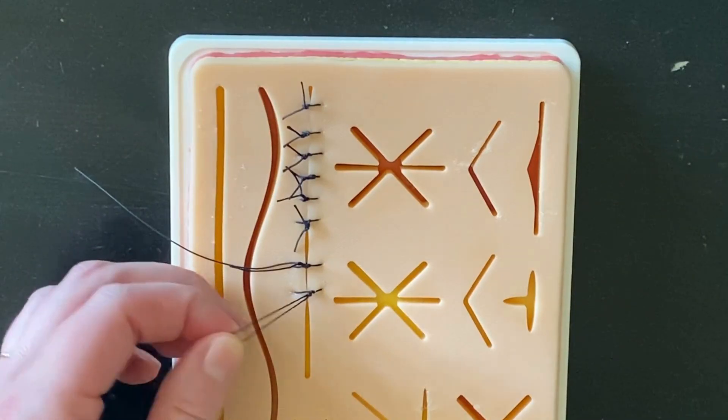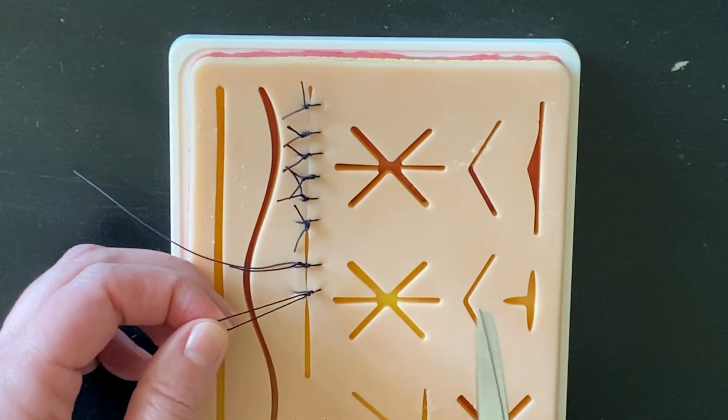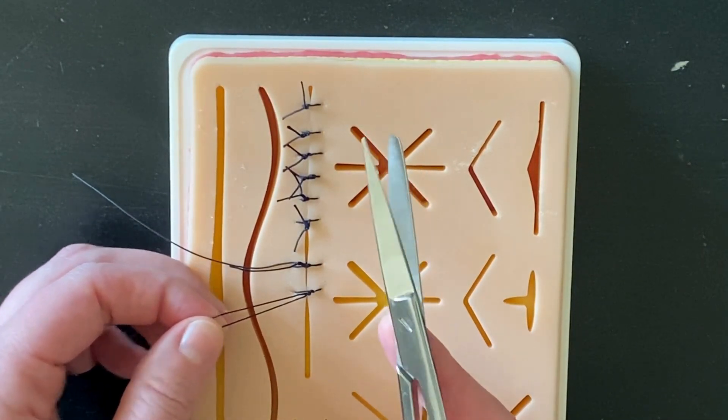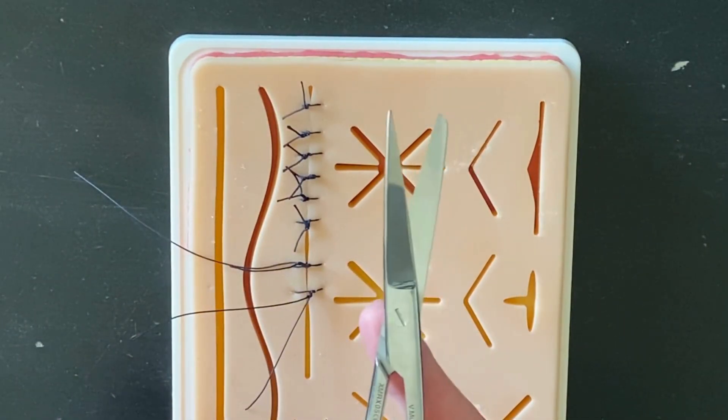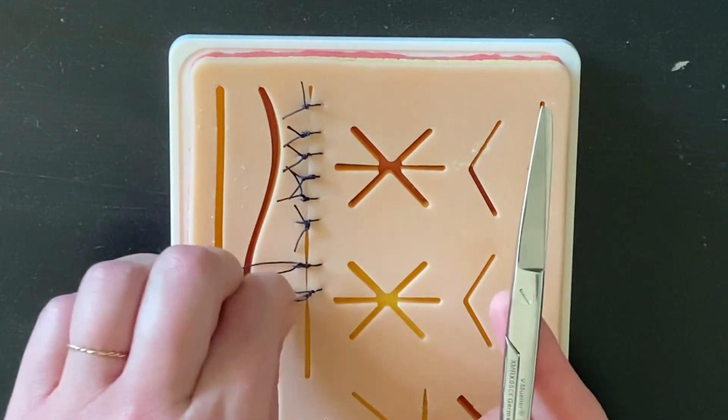Say your surgeon is across the table from you and asks you to cut a suture. Your suture scissors, which we've gone over before, have one small tine and one large tine. Usually I have my ring finger and my thumb in those eyelets.